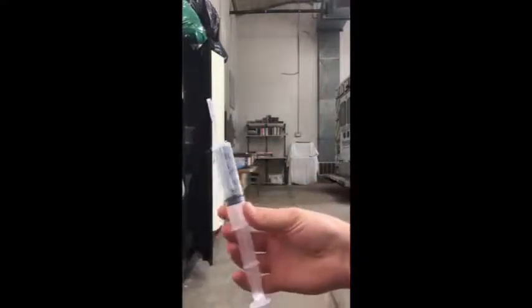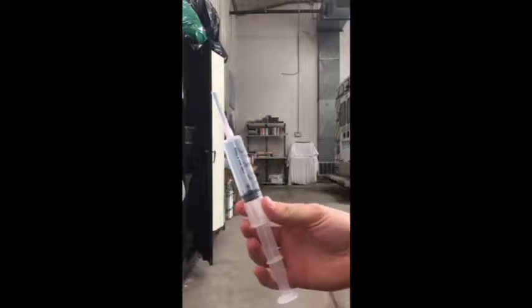usually about halfway through the process, I have to open up the roller clamp a bit more. And that way you get all of the air bubbles out. And it will not beep at you. So sometimes it is easier to use a syringe and a half set.